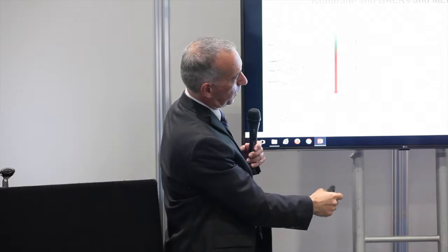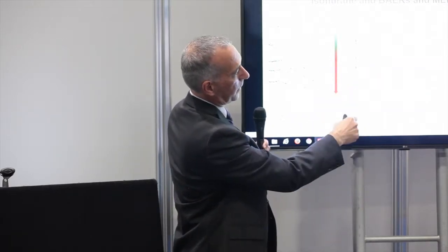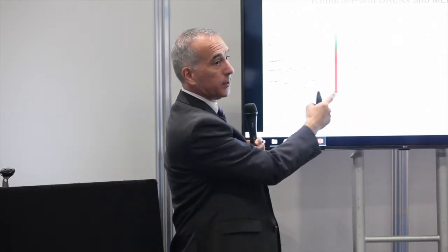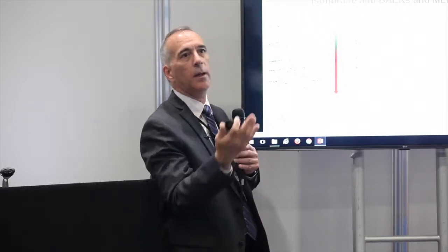Same here for our motor evoked potentials. They start out with a nice large response, and as the level of anesthetic goes up, we lose it. So it's hard to say at that point, unless we know what's happening with anesthesia, is this a real change because now there's an ischemic event or a compressive event, or is it an anesthetic change that we don't have to really let the surgeon know much about other than, maybe we need to lighten the patient up, etc.